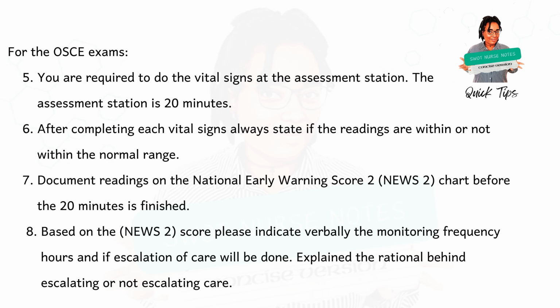You are required to do the vital signs at the assessment station. The assessment station is 20 minutes. After completing each vital signs, always state if the readings are within or not within the normal range. Document readings on the National Early Warning Score 2 chart before the 20 minutes is finished.